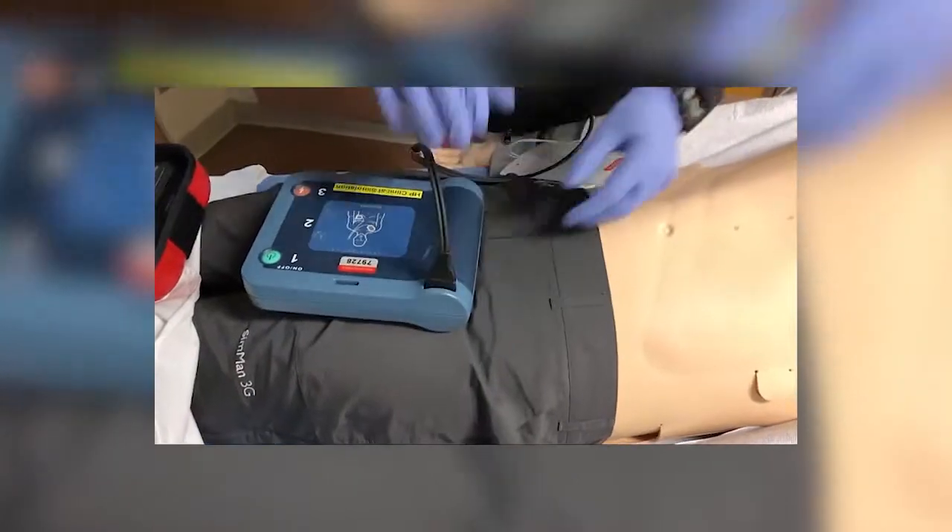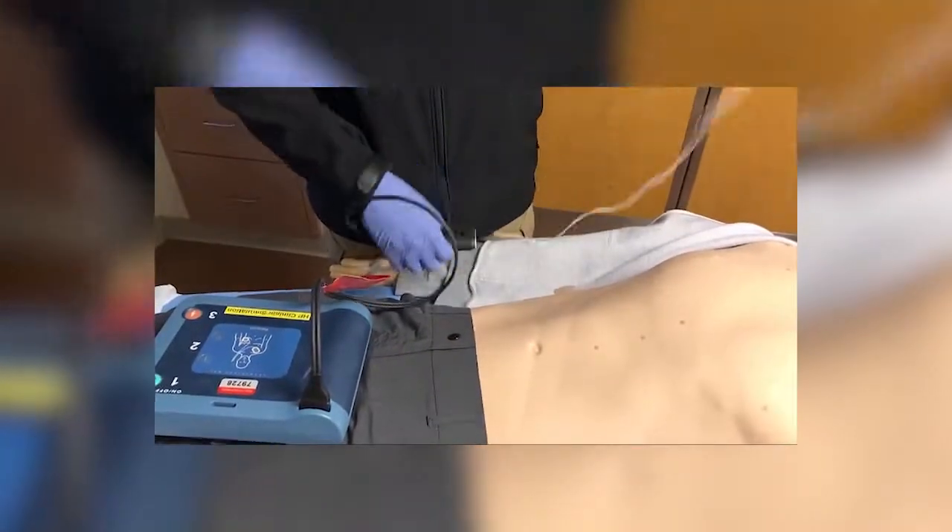You can store this in your defibrillator or AED. I'd recommend having it attached to the pads even though it's not very realistic — it just saves time and confusion with the system.